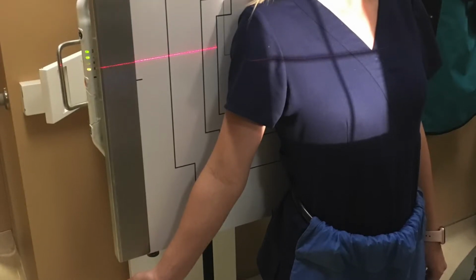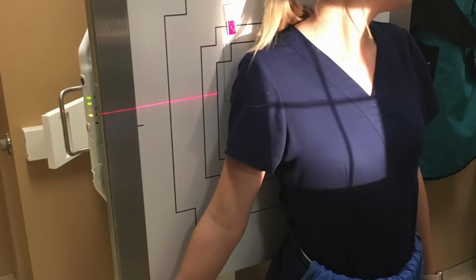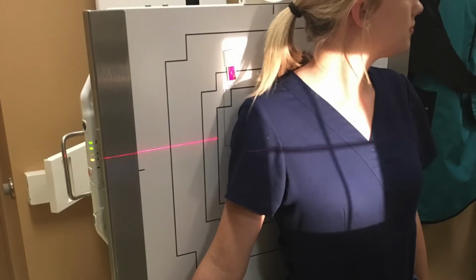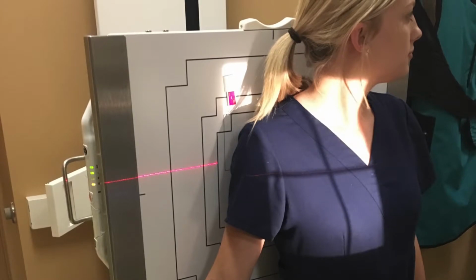Abduct the patient's arm slightly, externally rotating arm until epicondyles are parallel to the IR. The CR is perpendicular to 1 inch inferior to coracoid process. Collimate 4 sides and suspend respiration during exposure.